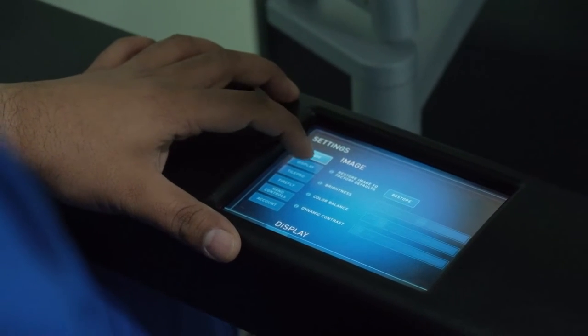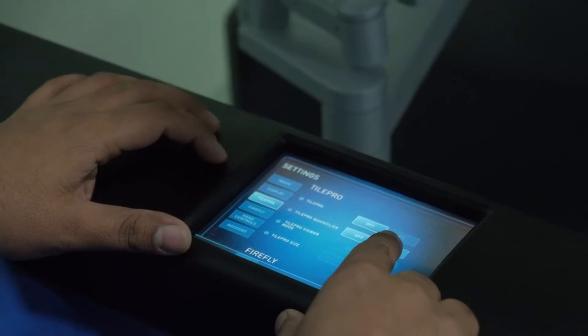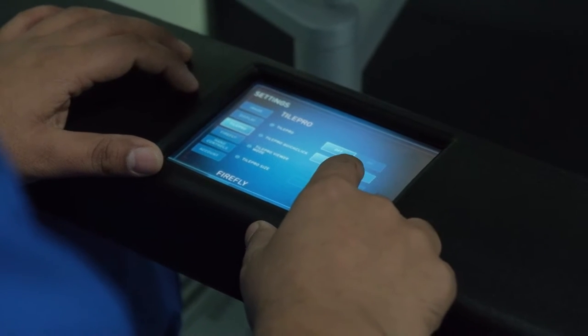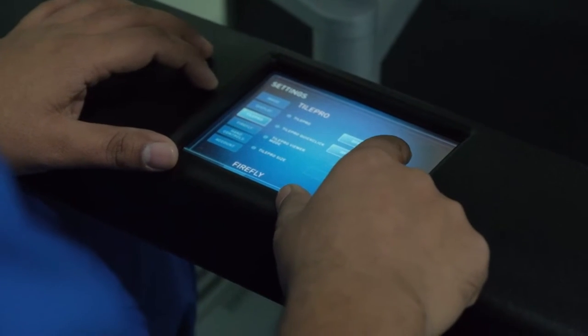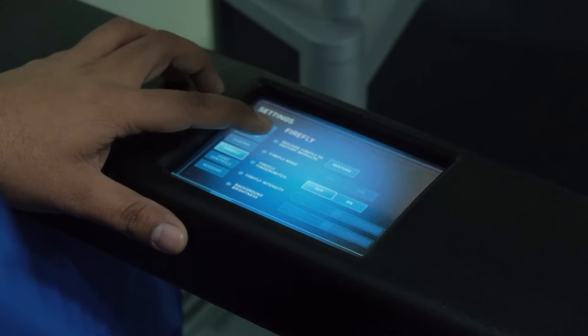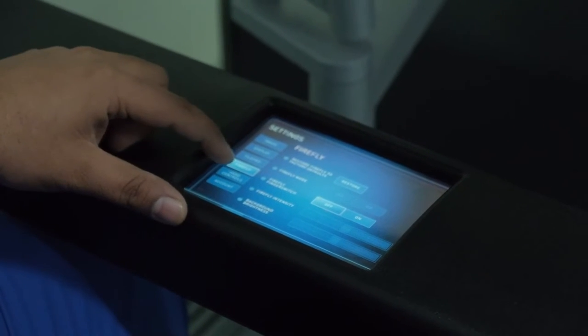So you can check for Tile Pro imaging. Tile Pro is integration of previous or pre-operative MRI or CT scan or Doppler imaging into the surgery. We can use that. We also use Firefly. Firefly is for indocyanine green fluorescence, which is an advanced imaging technology, and we can switch it on and off in between the surgery.